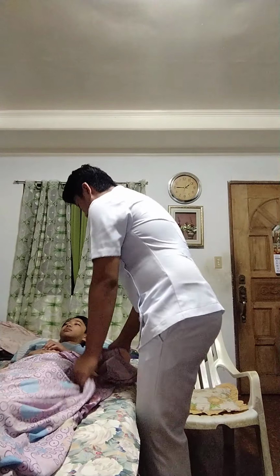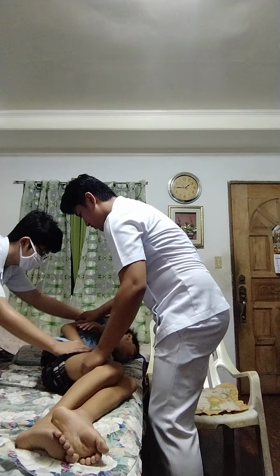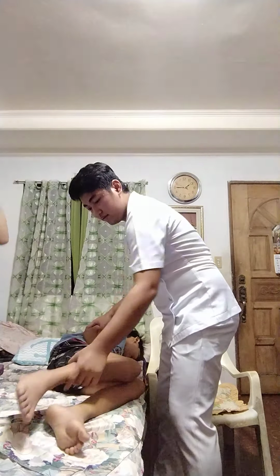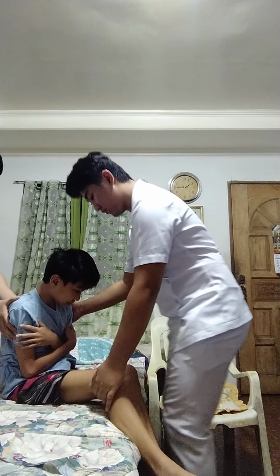Sorry. Sir, pwede po ba kayong mag-send dito? One, two, three, four. So, pwede po ba mag-send?